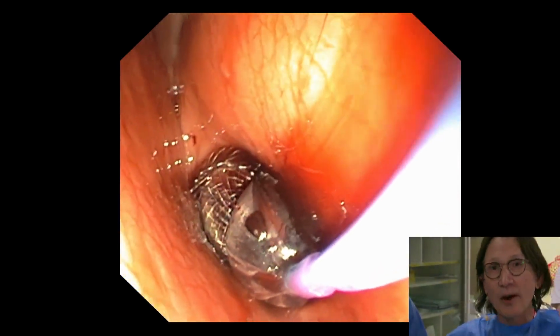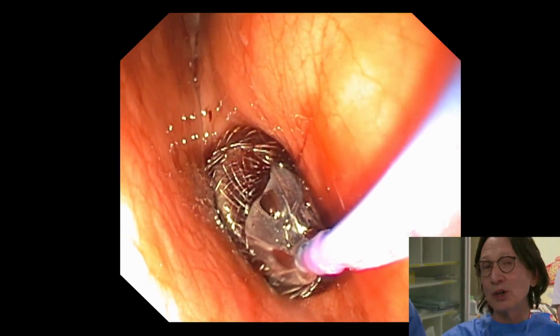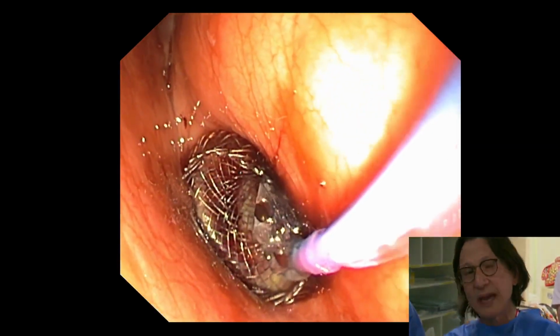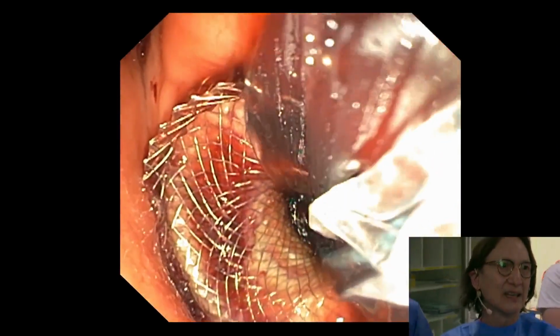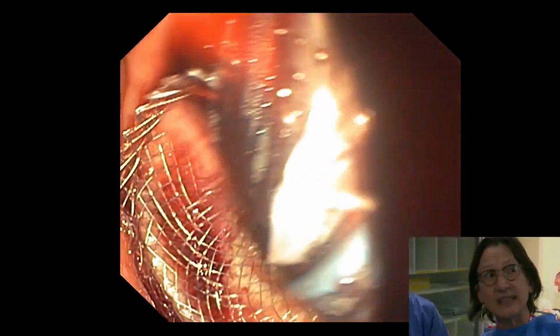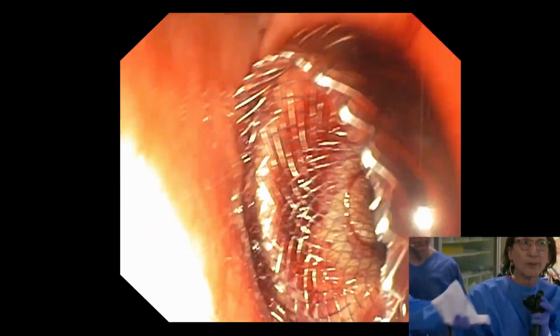She's deflating now. I'm going to switch out for a gastroscope, and then I'm going to go inside. I'm going to use a therapeutic gastroscope, and we're just going to go inside and try to clean out as much as we can. So you inflated to 18, correct? Yeah. Okay, good. So I'm just pulling out to the maximum. And usually you can sort of look inside a little bit. But I'm just going to switch out now. And we have to move to the next room.